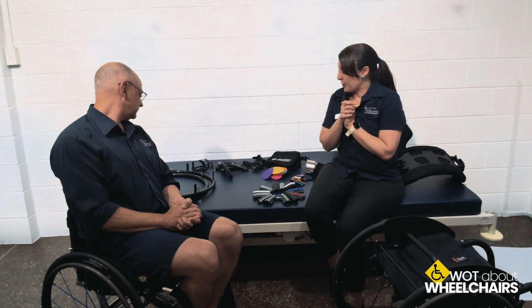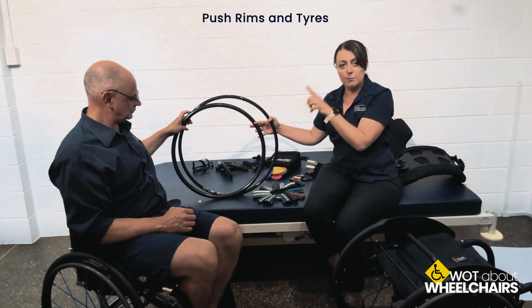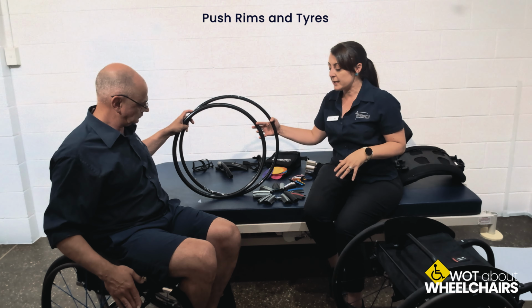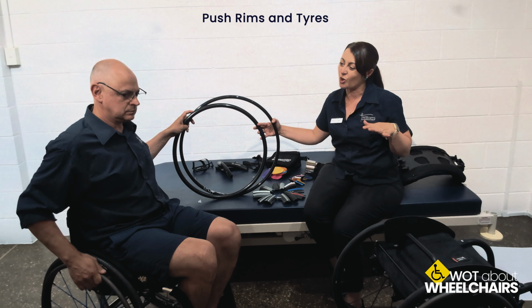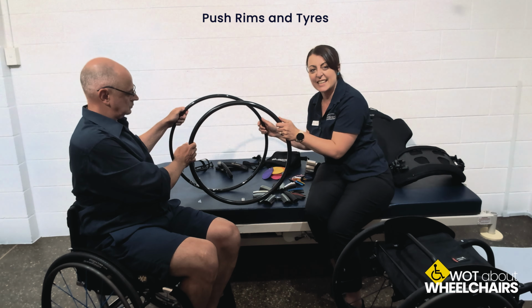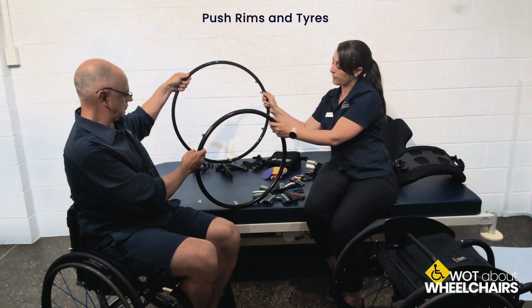So here we go. One of the things before we get to the fun choices, there are some functional things as well that we need to think about. In an earlier video we touched on types of push rims. The one that Brad is sitting in now is brushed steel, and that helps with the grip. It's not quite as shiny, so it didn't get so hot in the hot weather. But these ones here are actually quite tacky to feel, and it means that if you're pushing with quite significant force, your hands aren't going to slip off the push rims. So this one's powder coated.